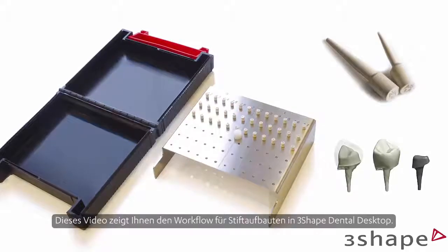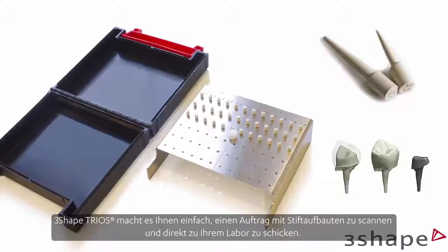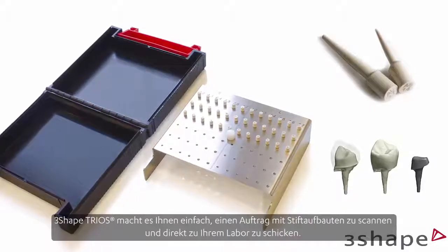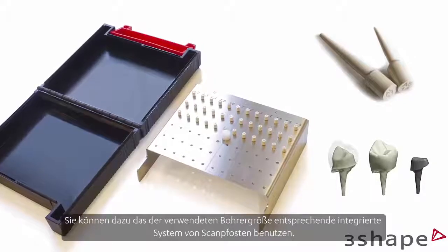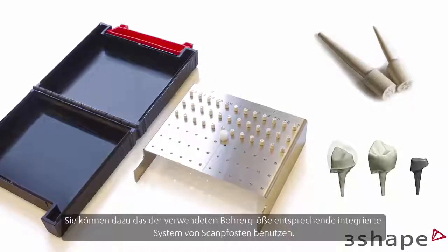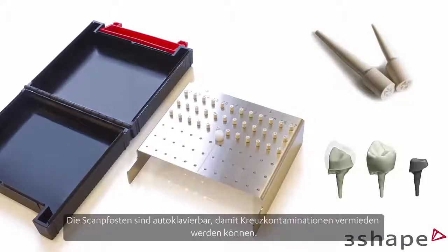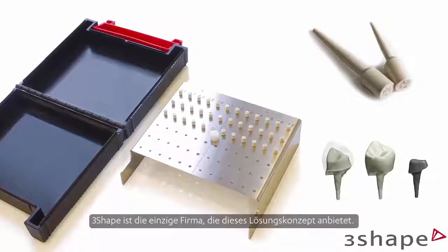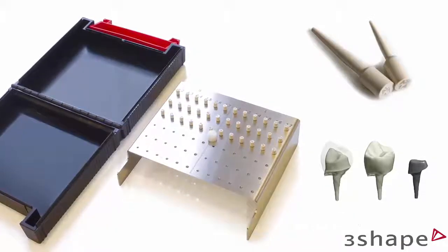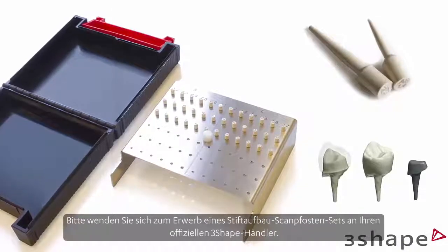This video will demonstrate the workflow for post and core in 3Shape Dental Desktop. With 3Shape Trios, it's easy to scan a post and core case and send it directly to the lab. You can do that using the integrated system of scan posts that correspond to the drill used. Scan posts can be autoclaved to avoid cross-contamination. 3Shape is the only company that supplies this solution. Contact your official 3Shape reseller to obtain a post and core scan post kit.